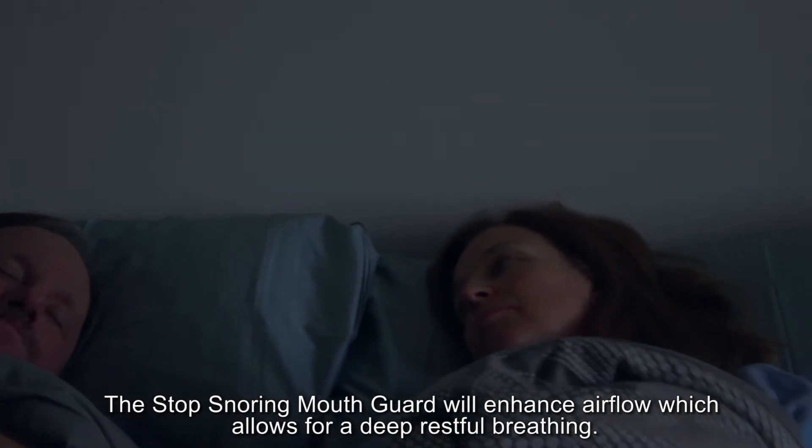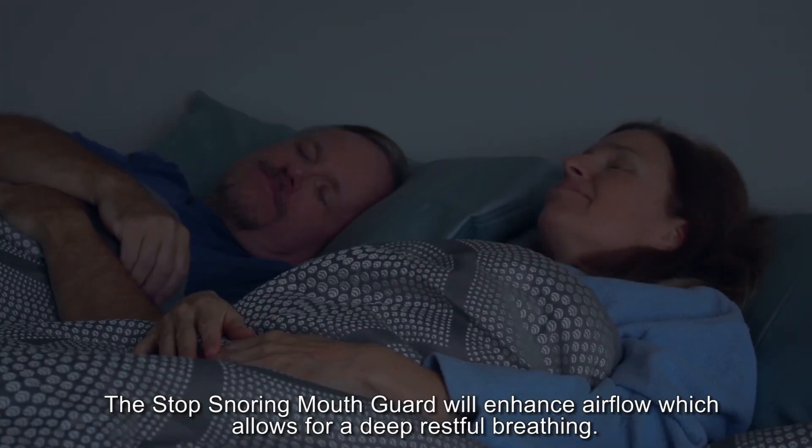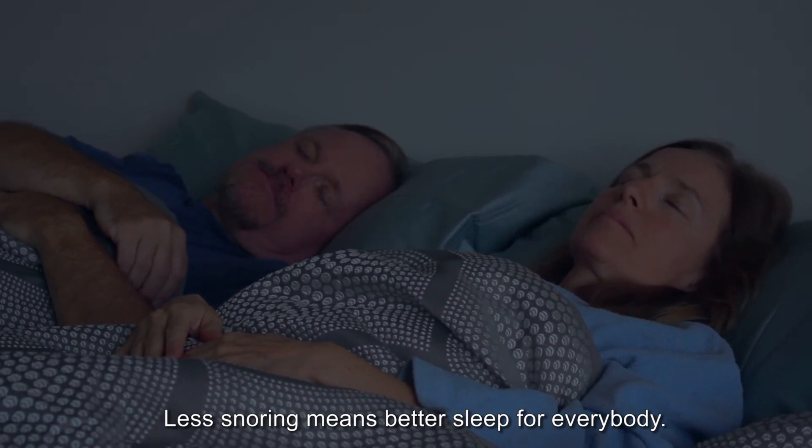The Stop Snoring Mouth Guard will enhance airflow, which allows for deep, restful breathing. Less snoring means better sleep for everybody.